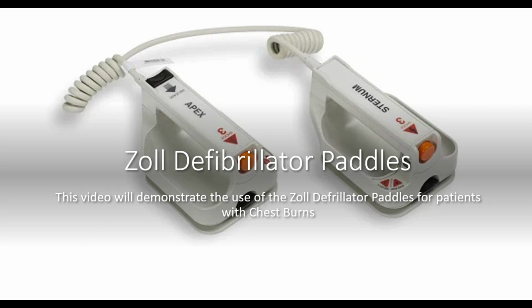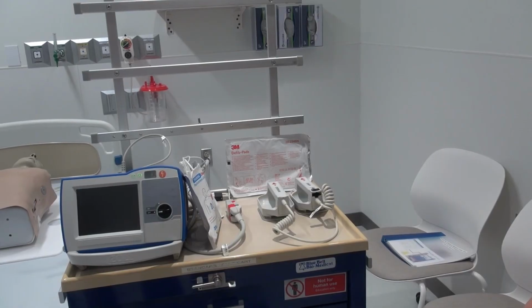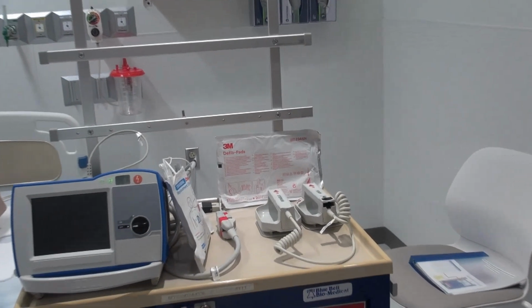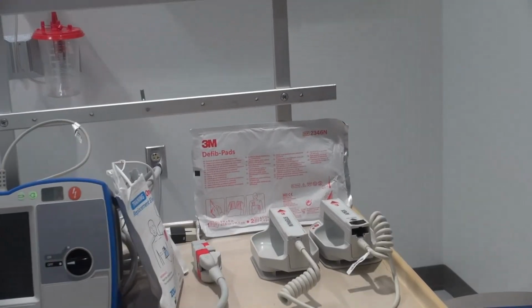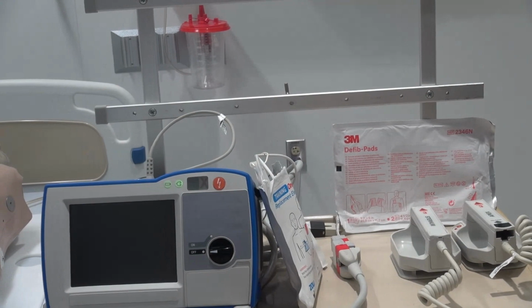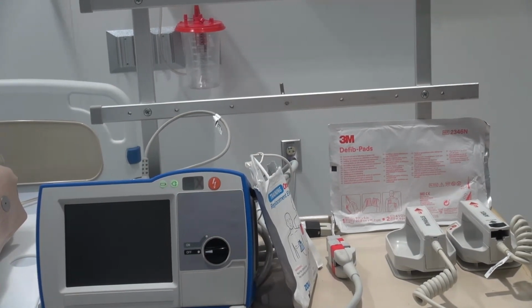This video will demonstrate the use of the Zoll defibrillator paddles for patients with chest burns. Defibrillator paddles should be used only on patients for whom the adhesive one-step pads are not appropriate. You must know where the paddles and gel pads are located in your area in the event of a cardiac emergency with a burn patient.